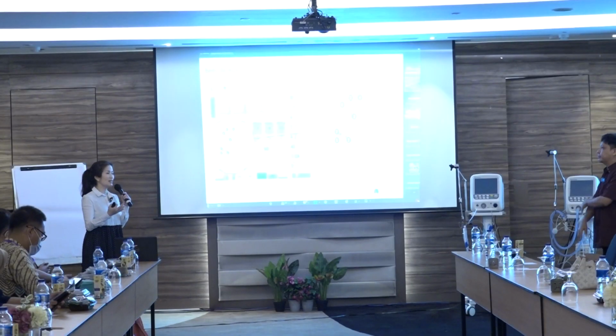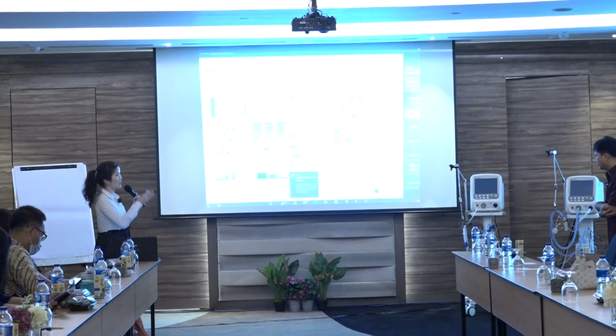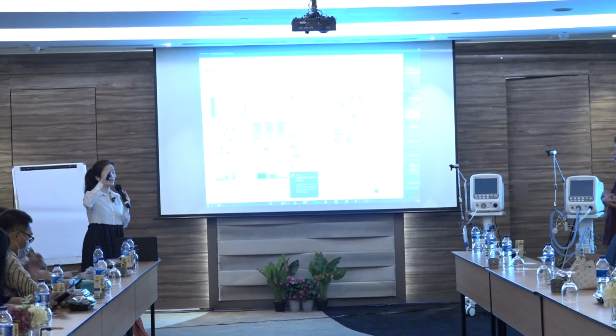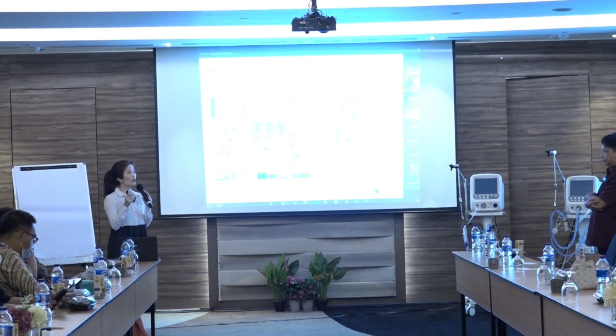For us, the maximum time at each PEEP level is actually 3 minutes, but once the patient reaches the mean airway pressure or the PEEP that you have set, you can start the FOT signal already. So it's maybe around 5 to 10 minutes. You will be able to finish the whole 7 steps.